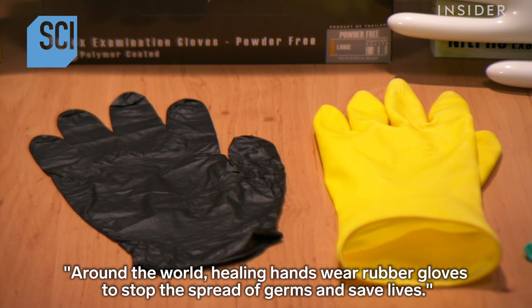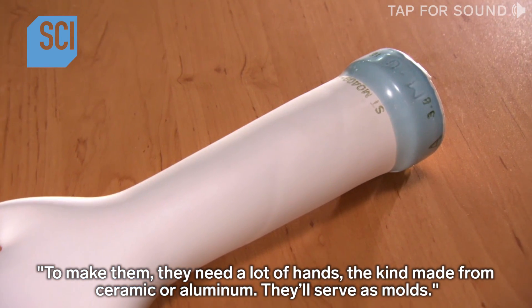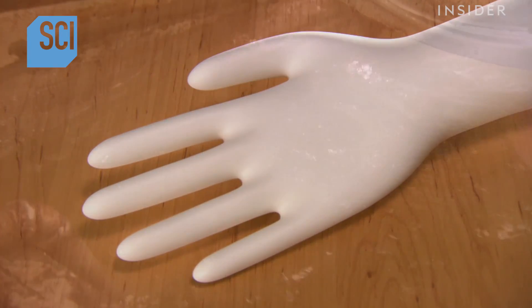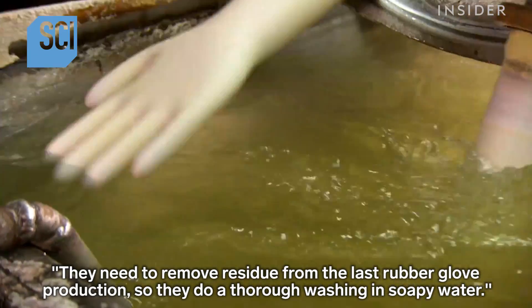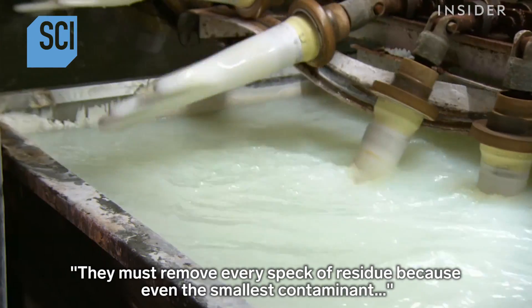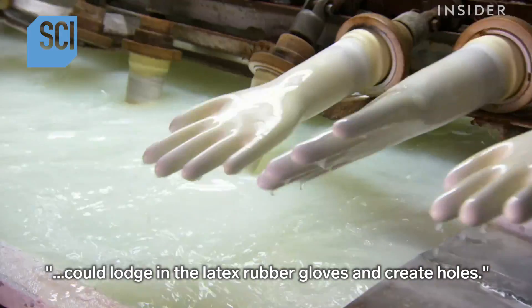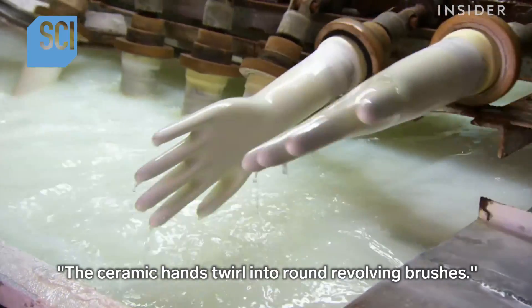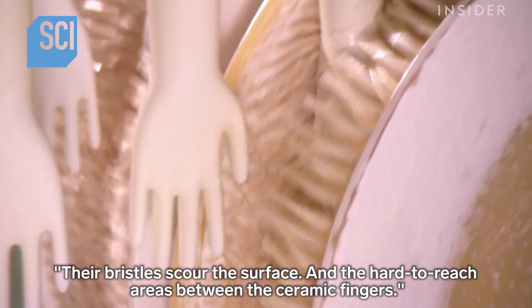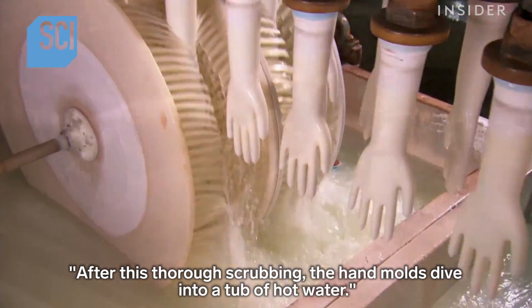Around the world, healing hands wear rubber gloves to stop the spread of germs and save lives. To make them, they need a lot of hands — the kind made from ceramic or aluminum — which serve as molds. They remove residue from the last production run with a thorough washing in soapy water, then in bleach, to eliminate every speck of contaminant. The ceramic hands twirl into round revolving brushes whose bristles scour the surface and hard-to-reach areas between the fingers.